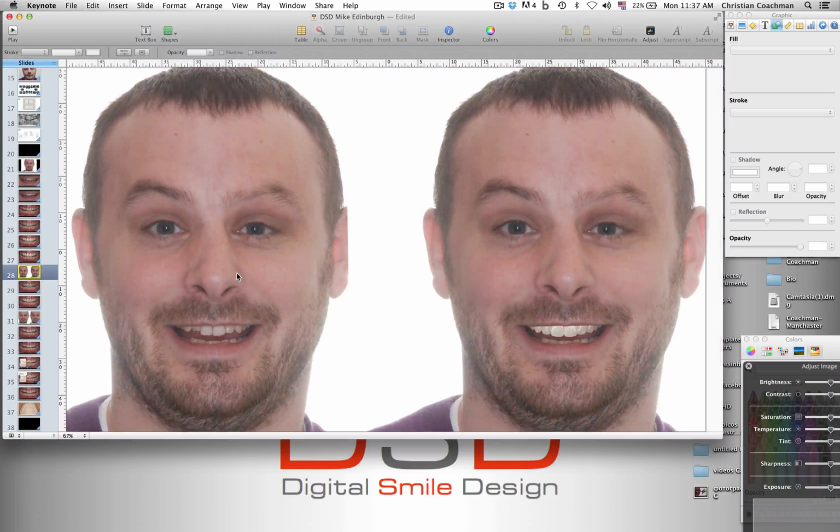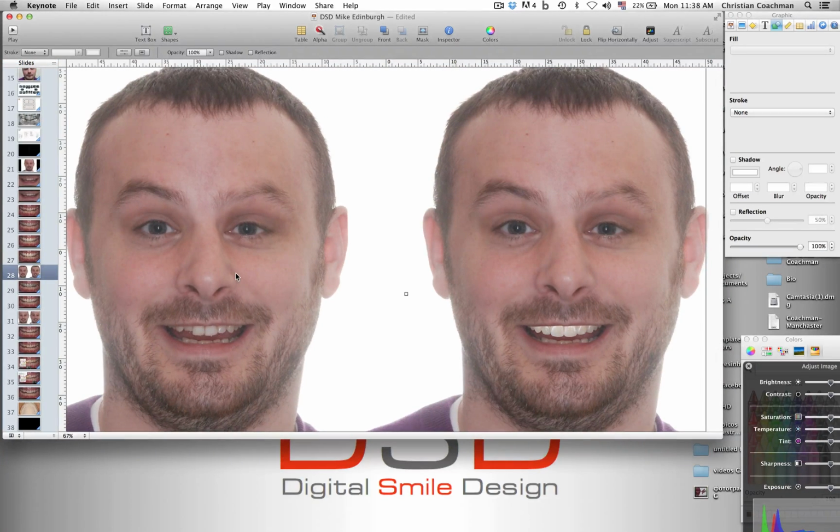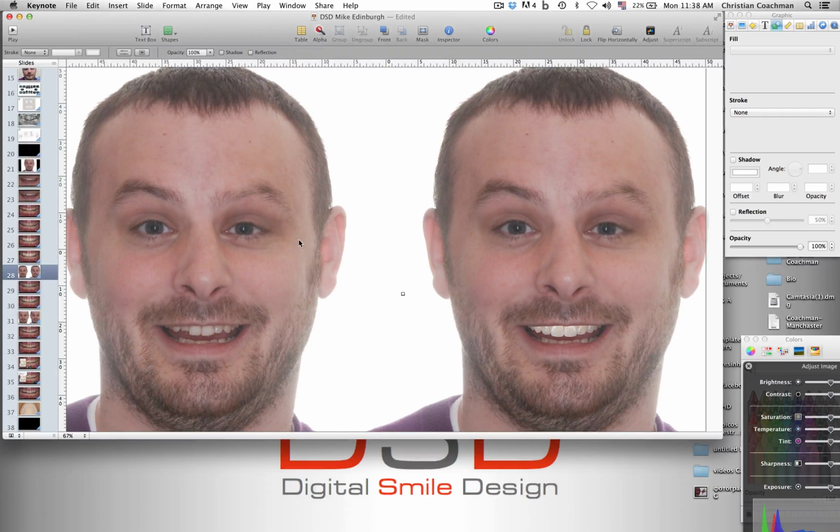I'm just trying to center here to see. That's it.